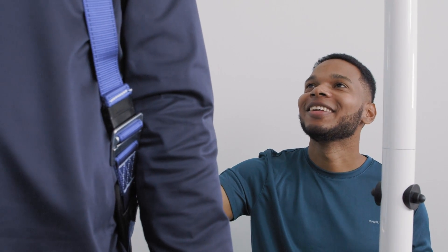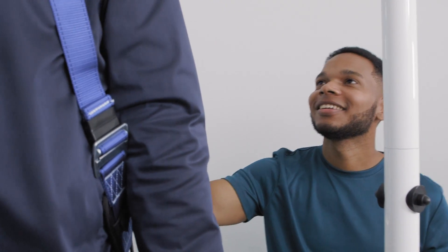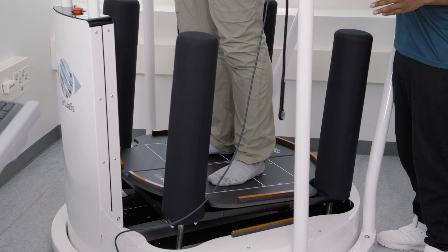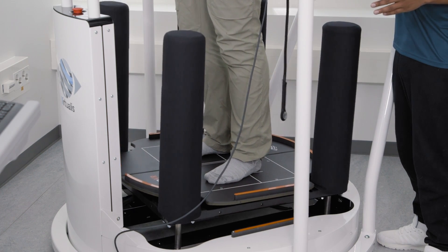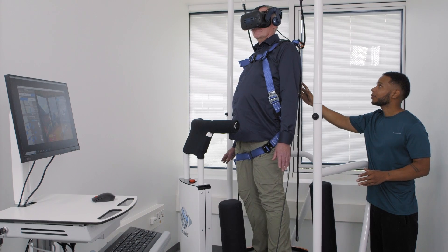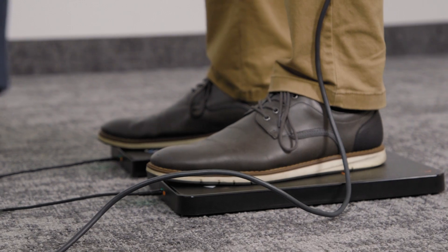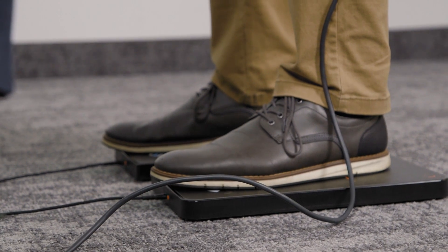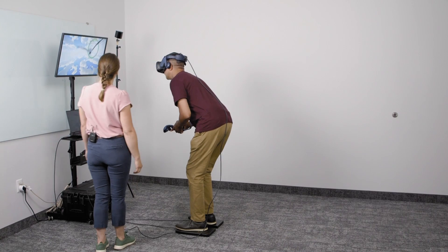The Virtualis Balance solutions include computerized dynamic posturography force plates or static force plates.